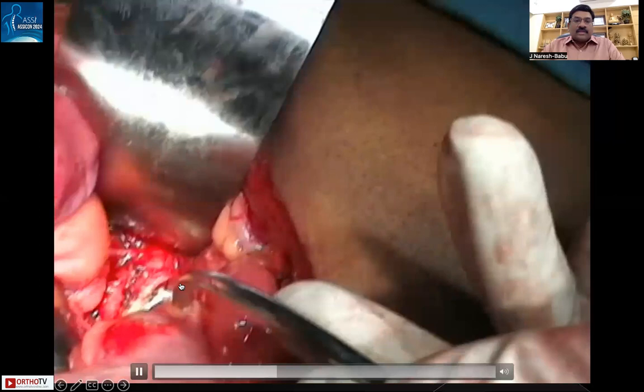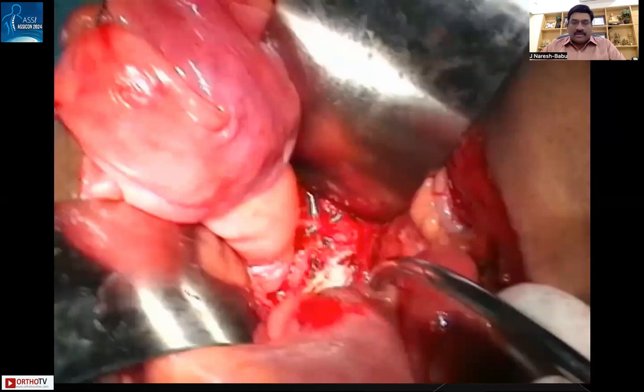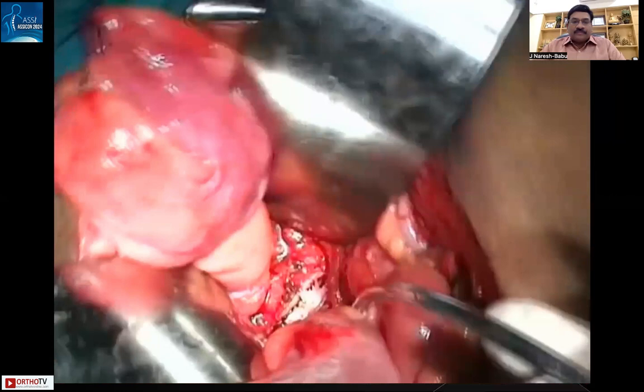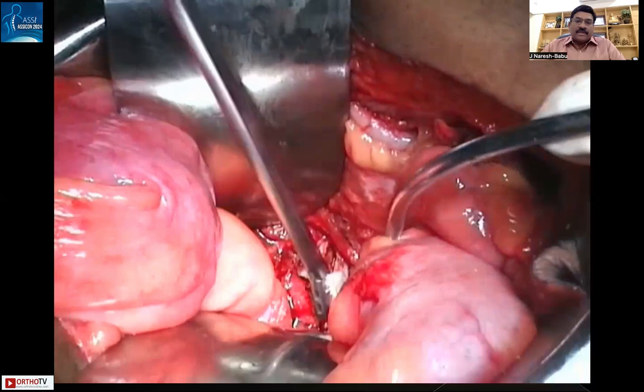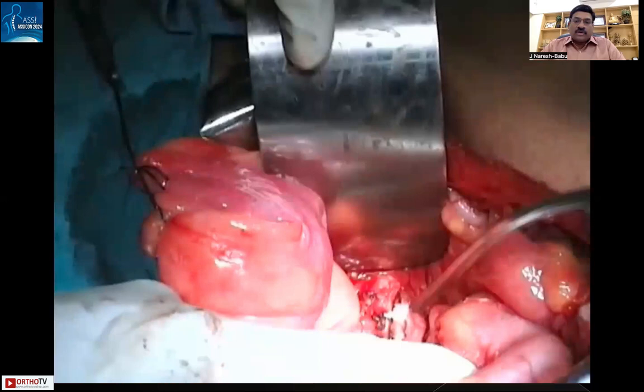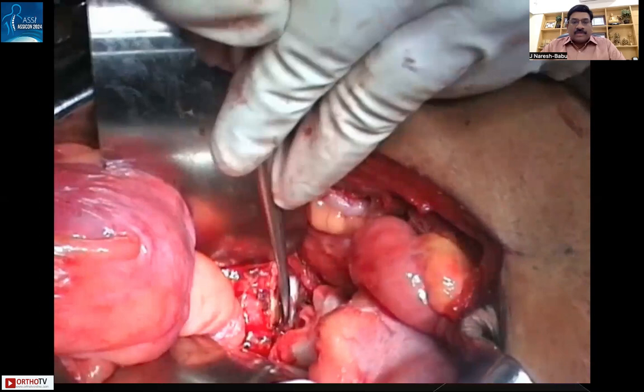Once bilateral ligation is completed, the anterior discectomy is performed thoroughly so the posterior procedure becomes easier. The anterior capsule is removed, the anterior longitudinal ligament is cut, the annulus is incised, and the disc is completely removed. The endplates are separated, and the tumor along with the sacrum is mobilized anteriorly. Partial separation of the sacroiliac joints on each side also facilitates the posterior procedure.